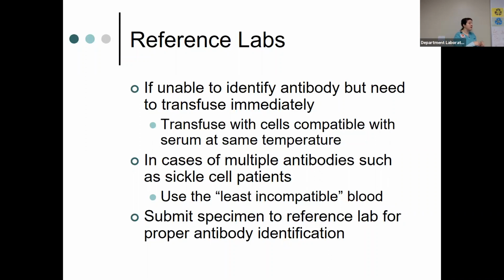Blood bank gets a sample. They do all of their testing before the Dara treatment so they can establish a baseline phenotype. I don't think you guys understand what a warm auto does. Your panel is going to be positive. Your IAT is going to be positive. Your DAT is going to be positive. Your elution is going to be positive. Everything is positive, right? And then your crossmatches are going to be incompatible.